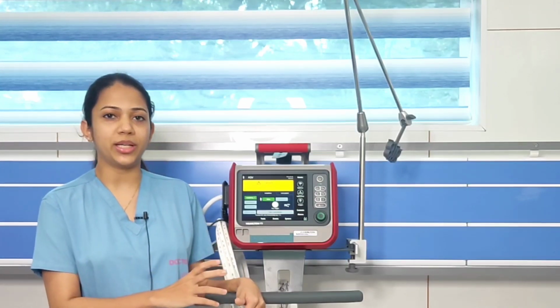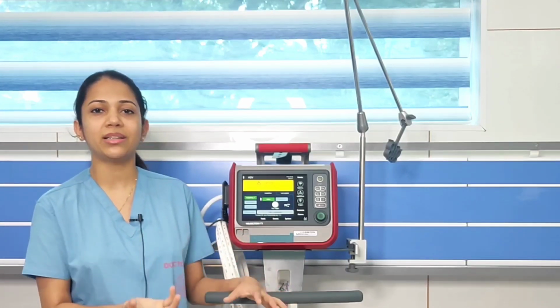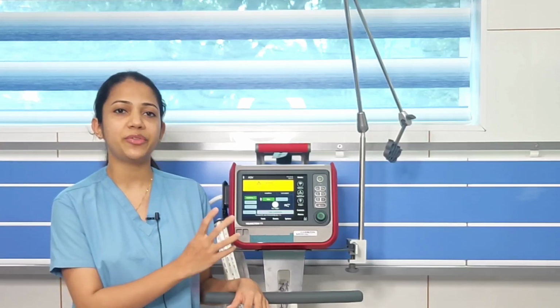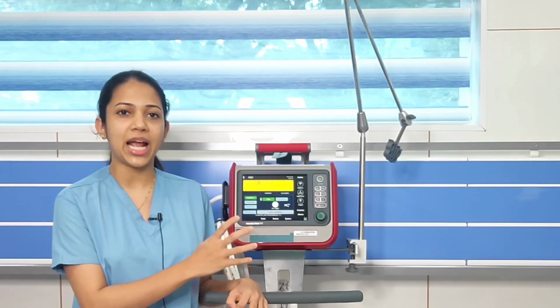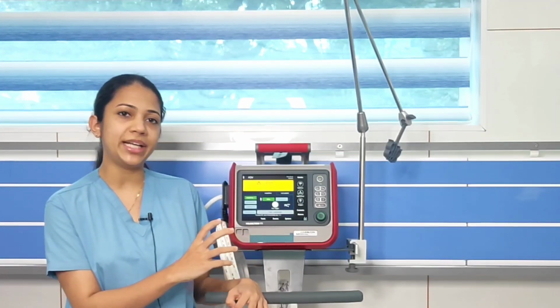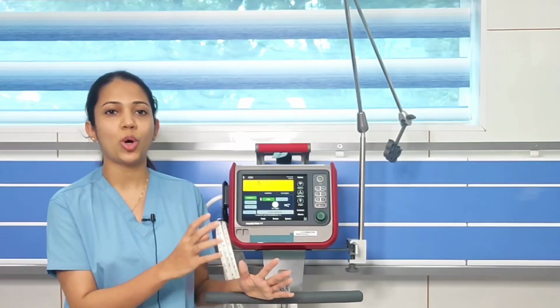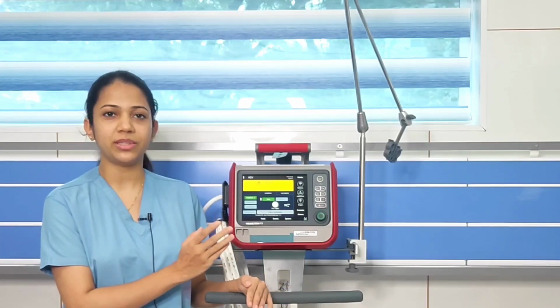Then we will discuss the other trigger, that is flow trigger. So what is flow trigger? Flow trigger is more beneficial, or better, than pressure trigger, because the ventilator will be sensing the difference in the flow of the ventilator and the patient circuit, and depending on that it will be providing breaths to the patient. So the ventilator will be sensing the difference in flow, not the pressure. So it is better than the pressure trigger.